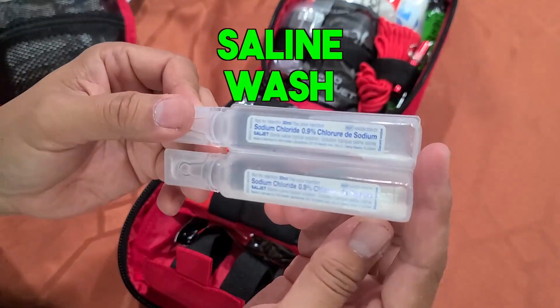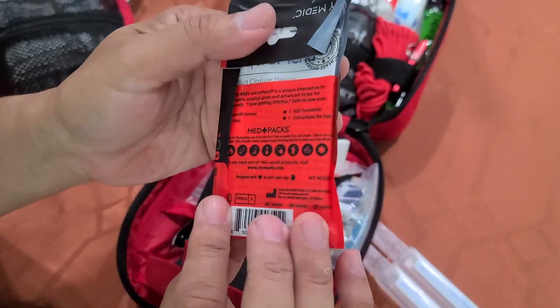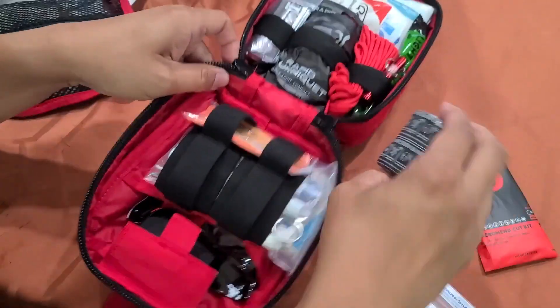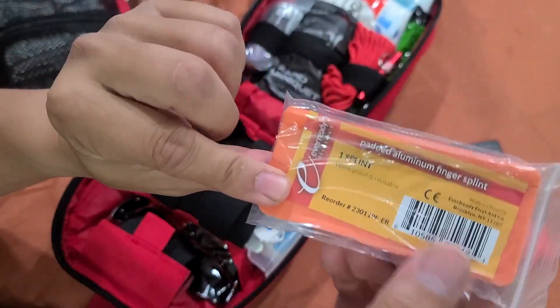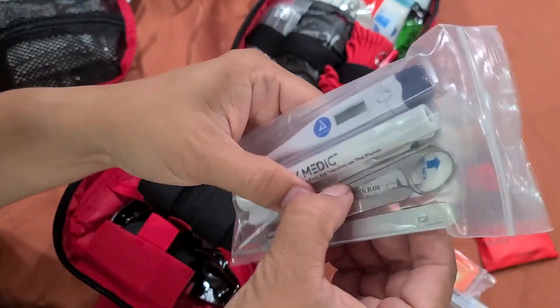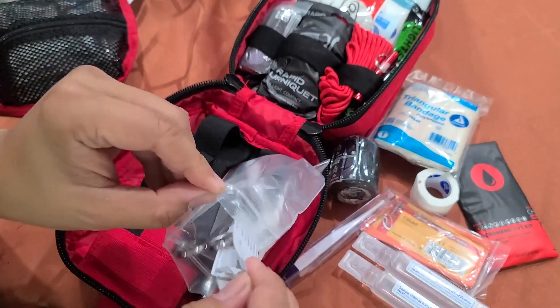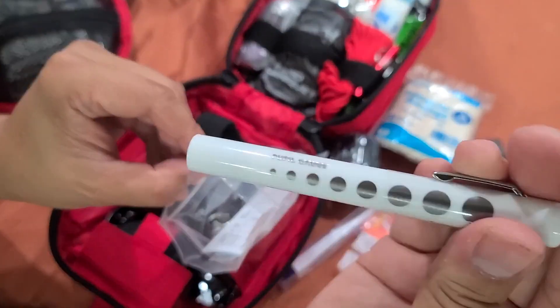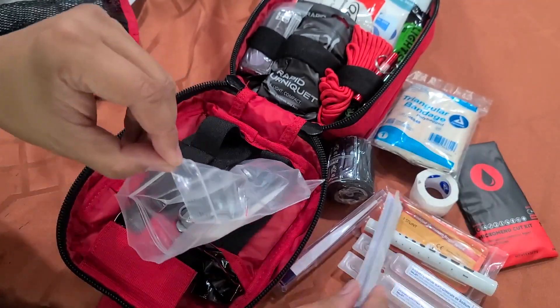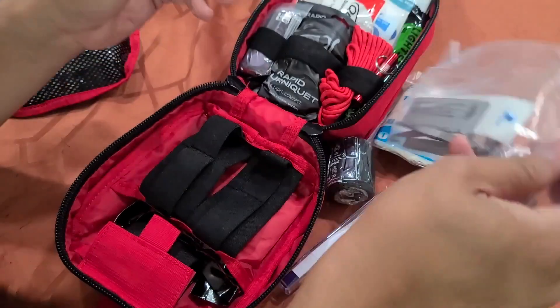Saline wash to clean wounds, eyes, etc. A microman kit for wounds. Bandage tape, other bandage wraps, a finger splint, and another bandage — so that's the bandage section. Scalpels and scissors. A thermometer. A little flashlight — you can check pupils with it or just see better since it's dark. Those are the scalpel blades. That's a lot of stuff.